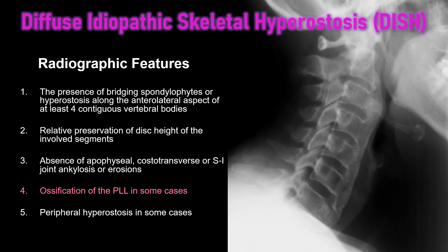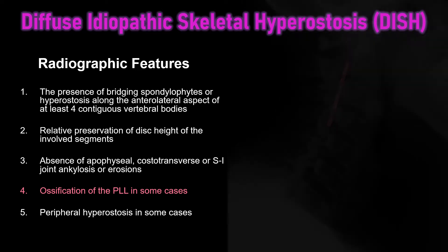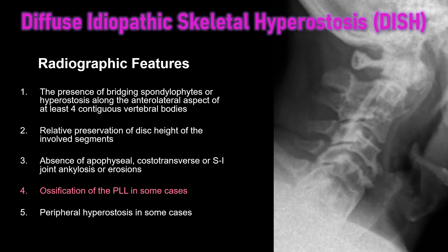In some cases of DISH there is ossification of the posterior longitudinal ligament, usually seen posterior to C2 to C5. If present, it can cause canal stenosis or other neurologic complications. It's not always present but something to look for. Here is an example of ossification of the posterior longitudinal ligament seen posterior to C2–C3.